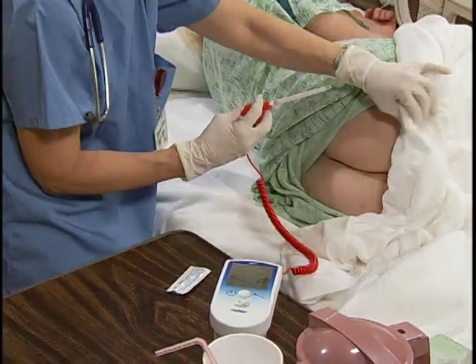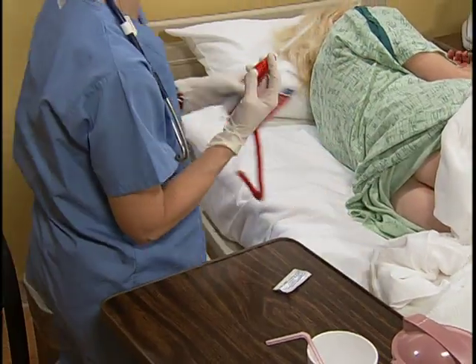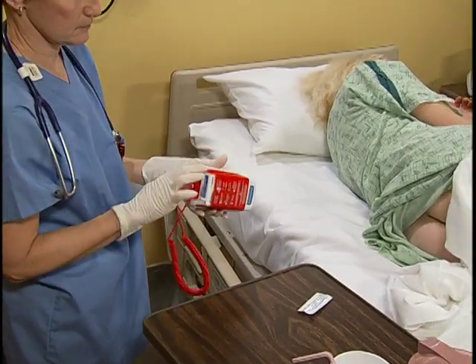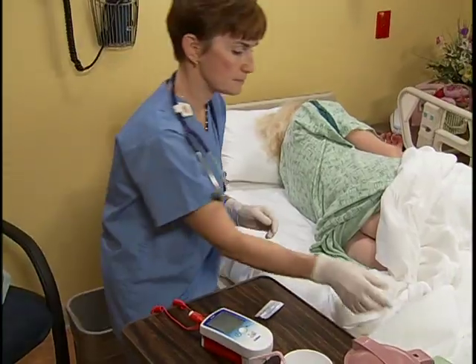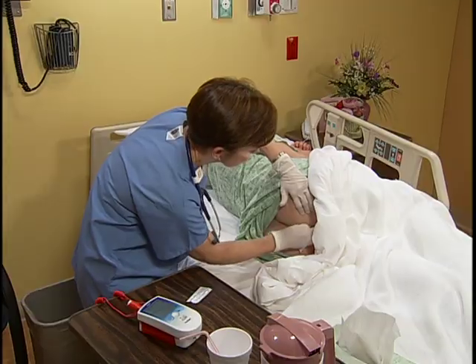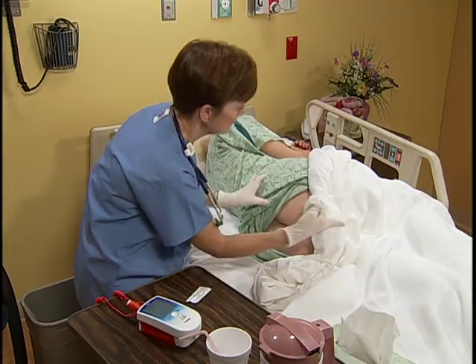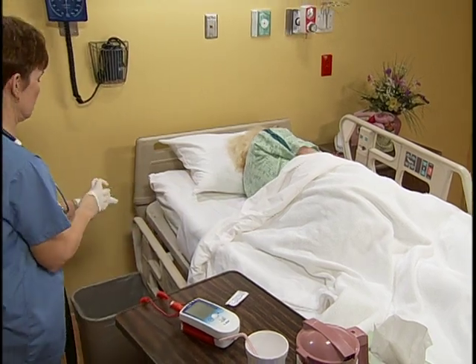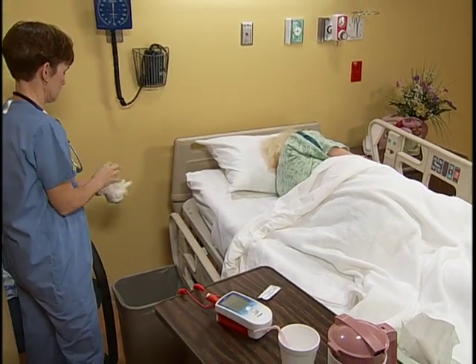Your temperature is 99.6. Tell the patient her temperature. Discard the probe cover and put away the thermometer and stem. Wipe her anal area with tissue to remove excess lubricant, then discard the tissue and your gloves in the appropriate receptacle.